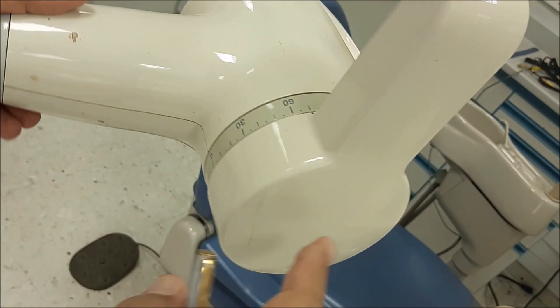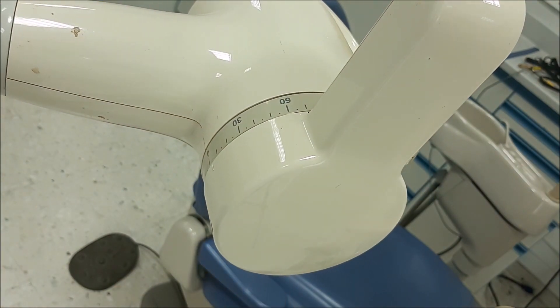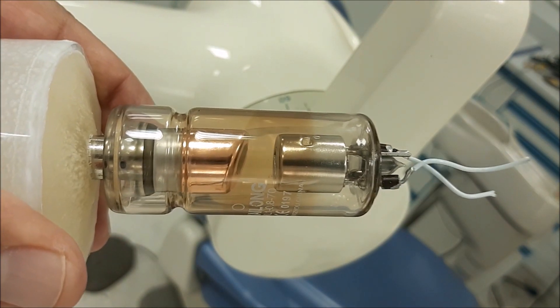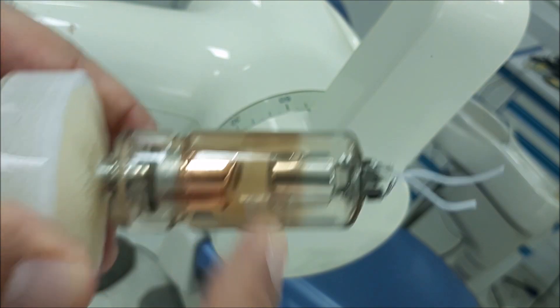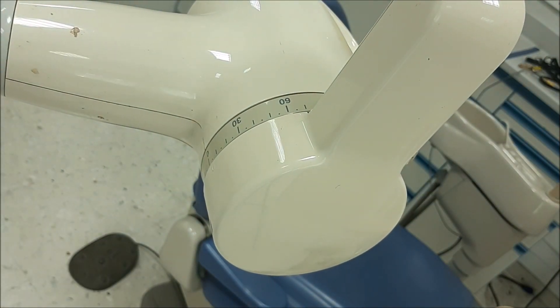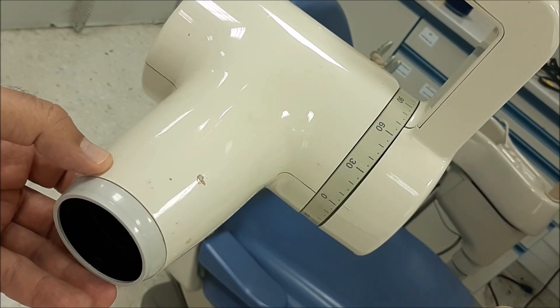This is the x-ray head, while the other part we talked about is the x-ray tube. This will generate the x-ray and house all the other components that are responsible for the production of x-rays.